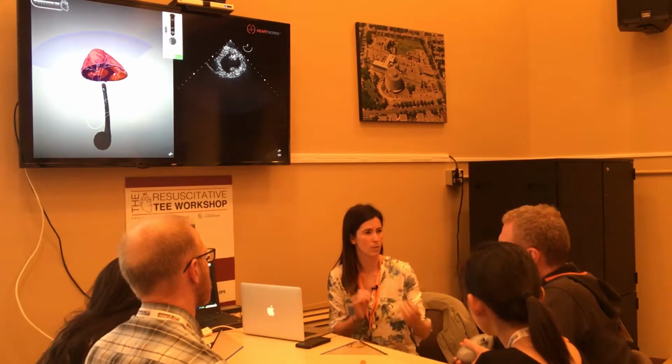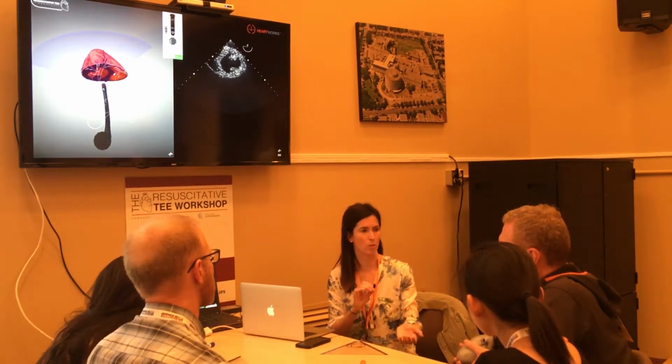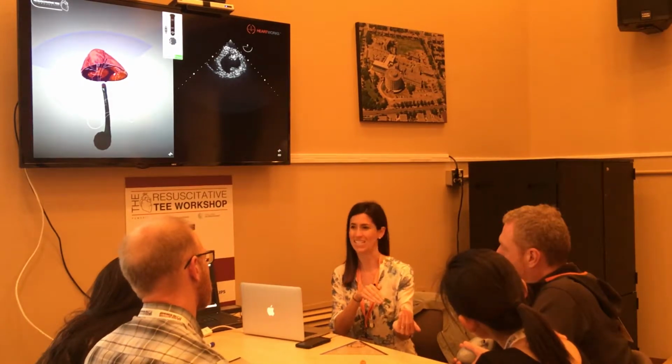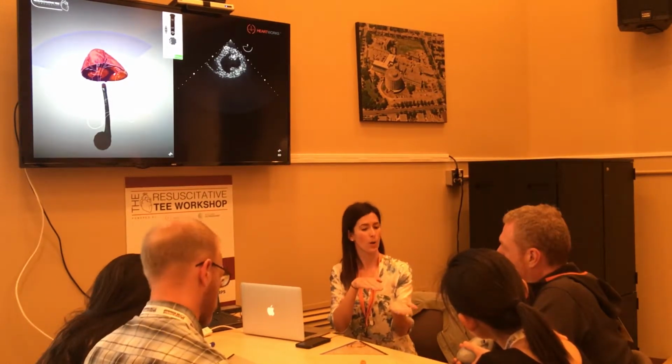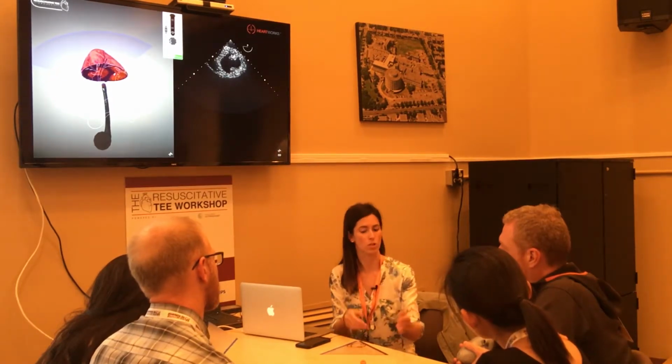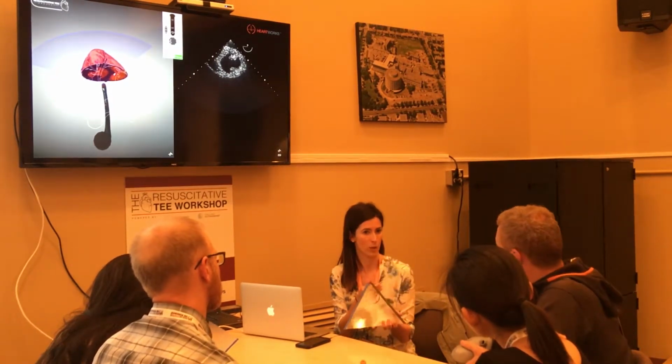Okay, so it can be a little bit difficult on actual patients. So sometimes we'll insert the probe, a little bit of flexion. Do I see anything? That's not great. Come back to neutral, maybe insert a little bit further, more into flexion to try and get this view.